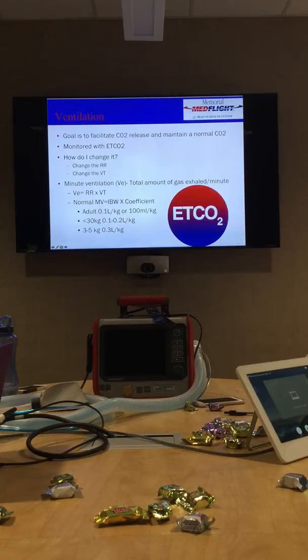And from watching the online videos, you saw that this vent in ASV mode works with percentage of minute volume. So when I was going through this, I thought, I'm not real familiar. I mean, we know, but let's break it down. So respiratory rate and tidal volume give you your minute volume. So I was wondering, how do they come up with an ideal minute volume? Like, how do they know that I should breathe 7 liters a minute or 8 liters a minute, or how do you figure that out? So I found that it's your ideal body weight.